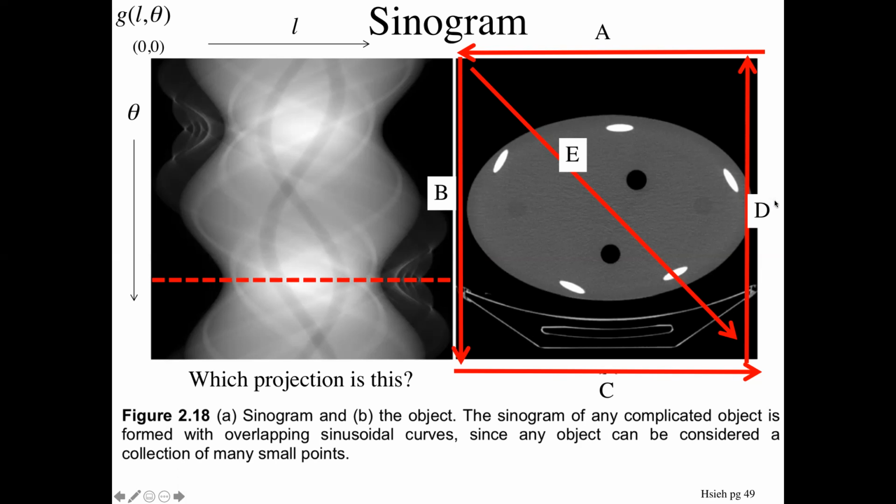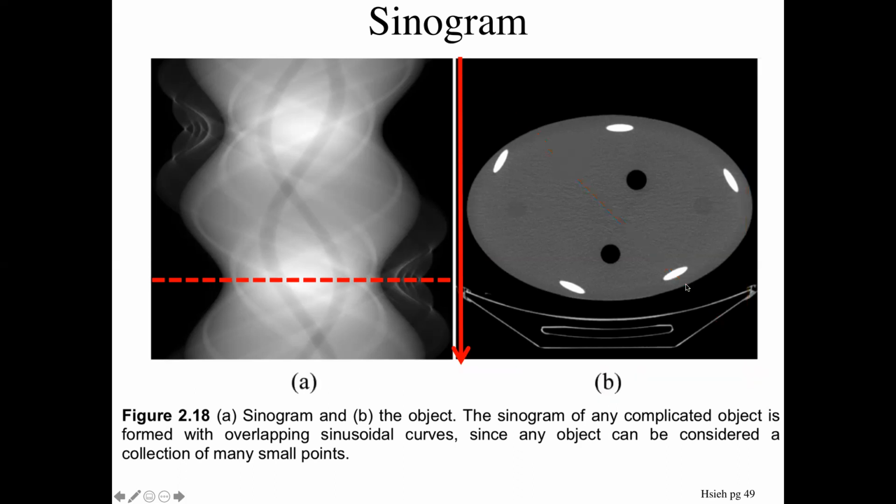So the X-ray source is over here, we're putting parallel beams through the object, and our sampling is this one. And if I move this along, I will get different projections. So this sample down here is equivalent to sampling with L0 here and L max over here.